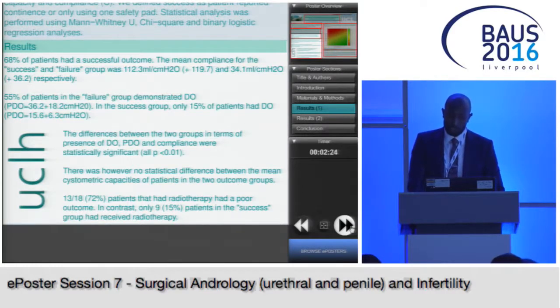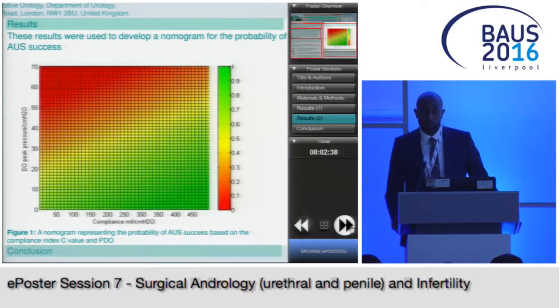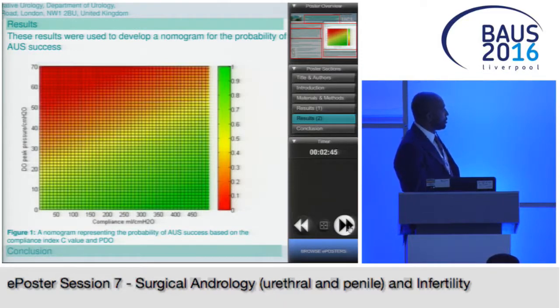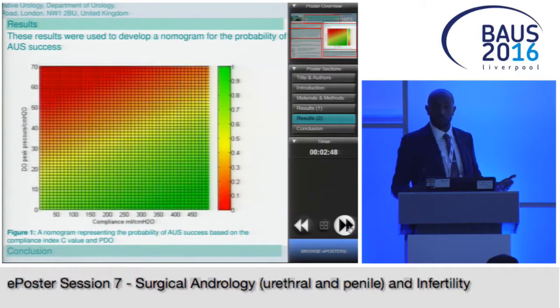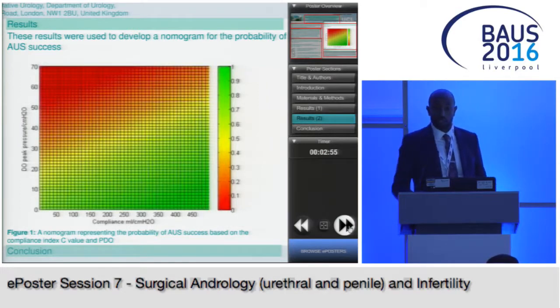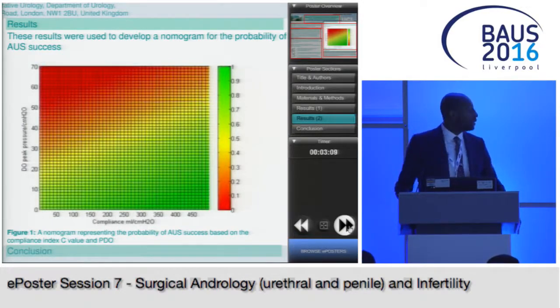So using this statistical difference in filling phase function between the two groups, and employing binary logistic regression, which is a statistical technique, we were able to generate a nomogram to deduce the probability of success using an AUS. On the x-axis is the compliance index C, which is essentially the volume infused divided by the change in pressure, against the peak detrusor pressure. For these two parameters derived from the pre-AUS urodynamics, you're able to counsel your patients as to whether they're likely to have a poor outcome, i.e. persistent incontinence, or not. If they land in the red or amber region, there's a low probability of success with AUS treatment. And the ones that land in the green section probably have a higher probability of success and ultimately being happier.